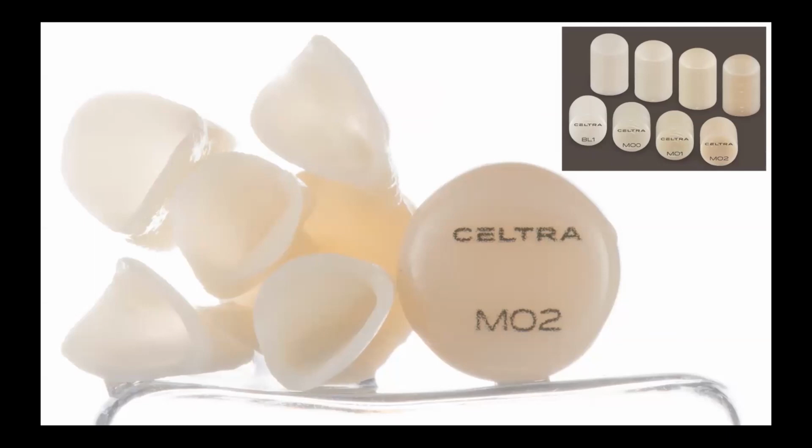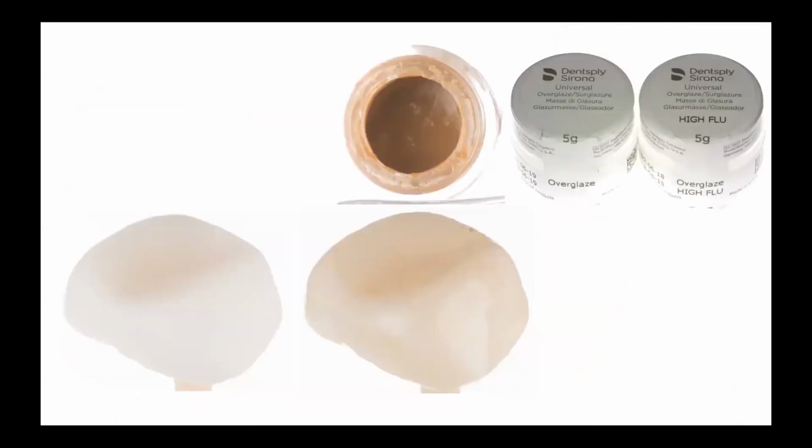For masking of discoloration, we use MO, medium opacity ingots, but this is not the only solution, because bleach ingots can mask the discoloration too, due to the brightness. In this case, we need to create the proper shade of our framework, to correct the shade, to check it with the help of shade stain. In our system, its name is body stain.